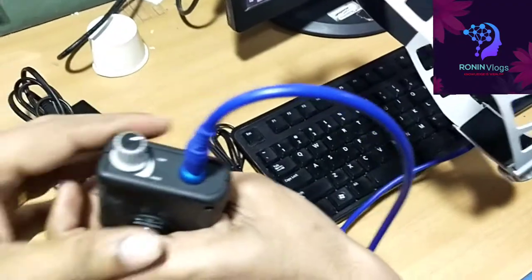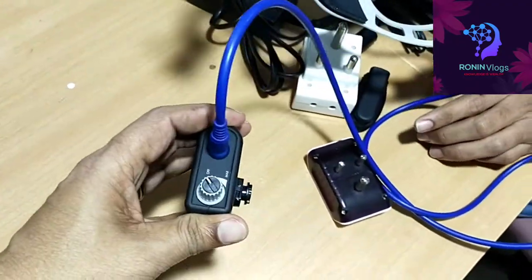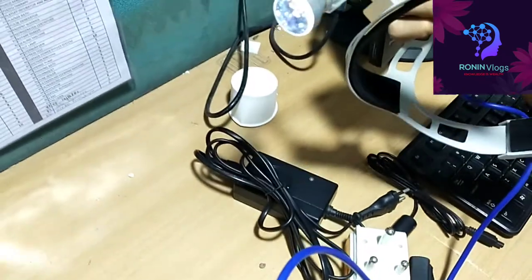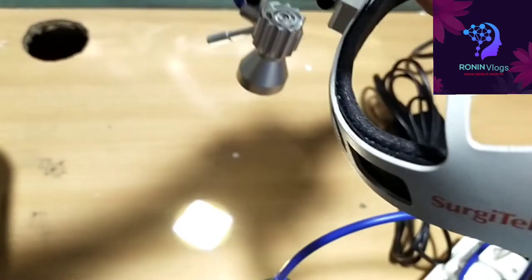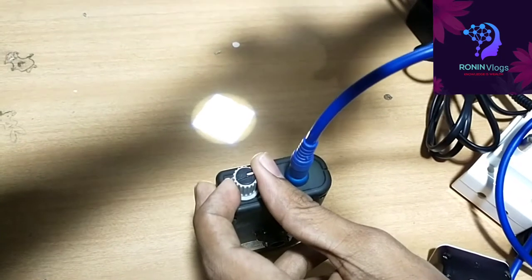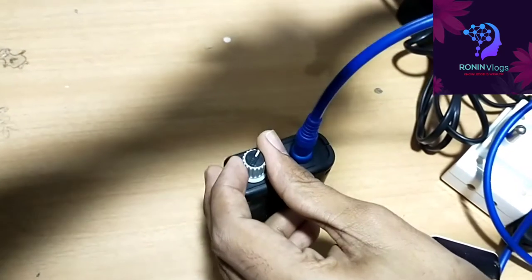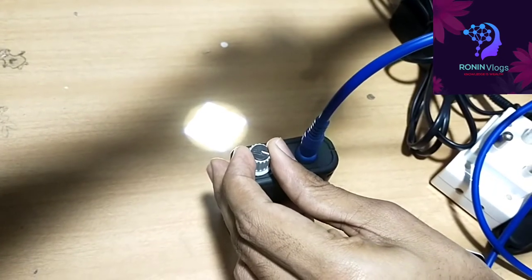Not too many functions — just on/off the intensity, hold, same button, and it's high intensity. The battery backup is eight hours with two hours charging. This is very useful during surgery — we can adjust the light intensity, on/off, everything with a single button.